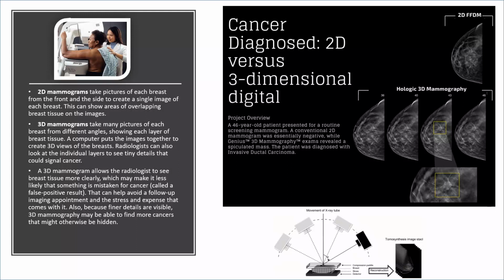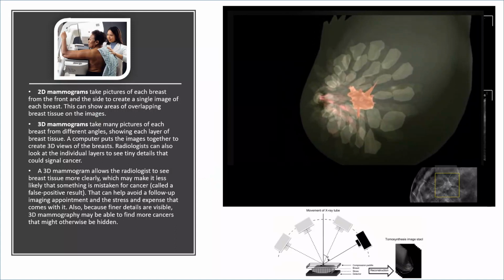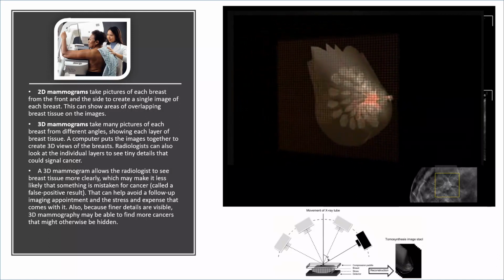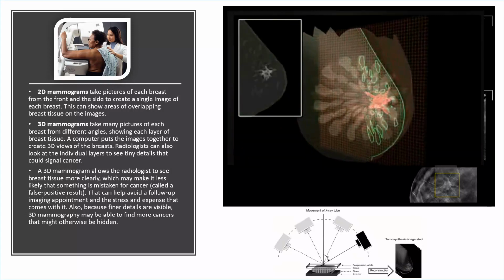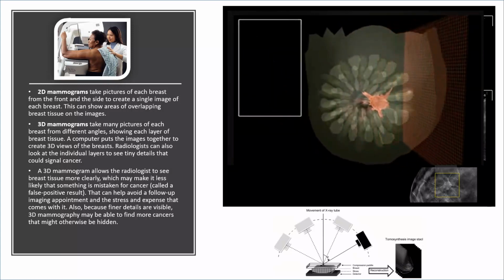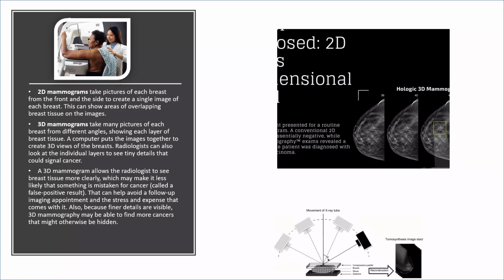Most people believe that mammography is done just for cancer, and this is not true. A woman's breasts change over her entire lifetime, and there are many different types of pathologies that can be demonstrated mammographically. There is a trend that two-dimensional radiographs, or traditional radiography, is being replaced by three-dimensional radiography, which is basically tomosynthesis, or a CT of the breast, where you can look at individual slices of tissue.